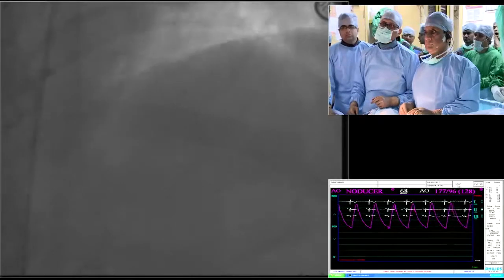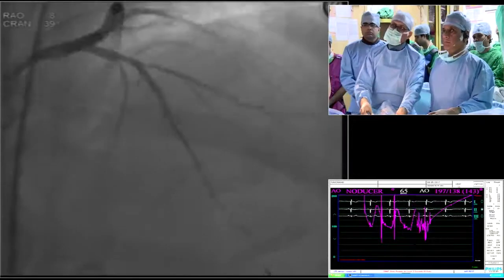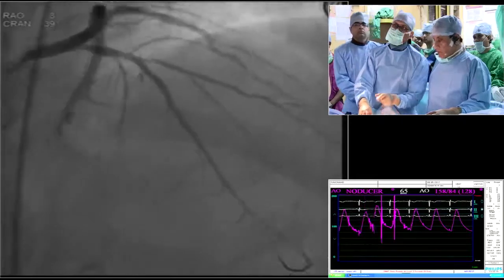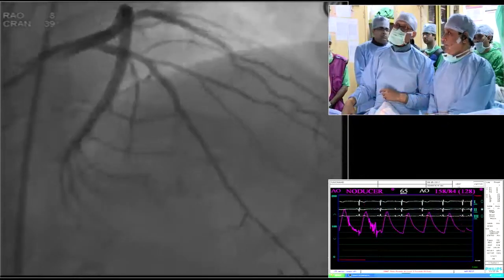12. 14. Good. Negative. Okay. Let's take a picture. Definitely has improved the proximal segment. Yeah, definitely, and angiographically it's perfect. So I think, if it's okay, we saw that it was the proximal segment only. We have post-dilated with a 3.5 at 20 atmospheres.